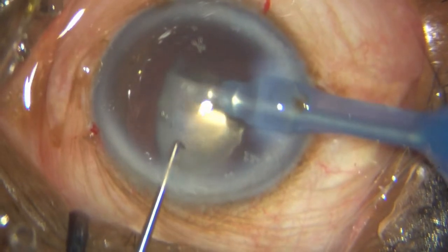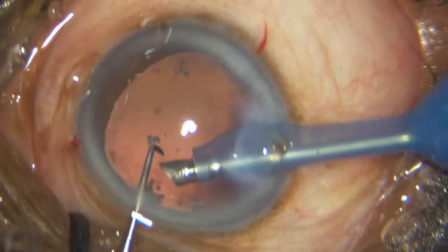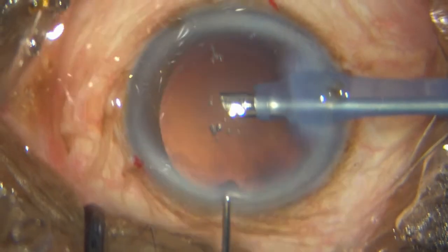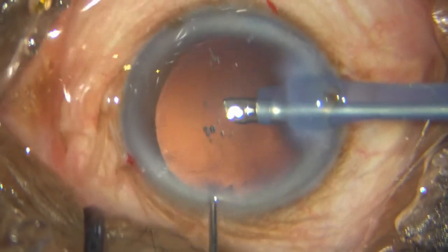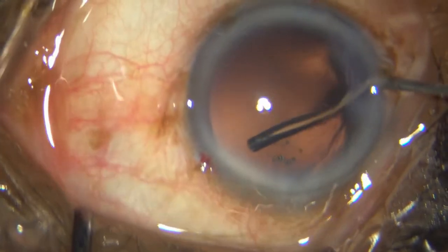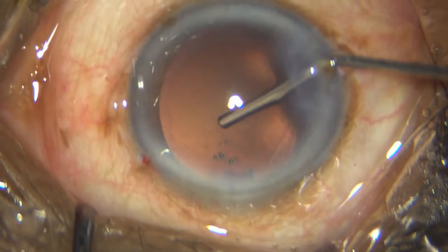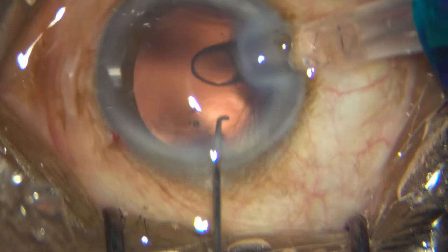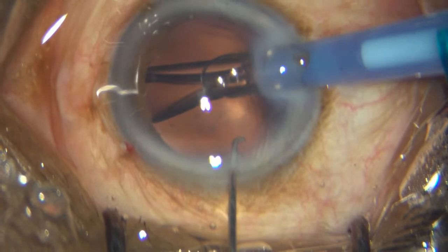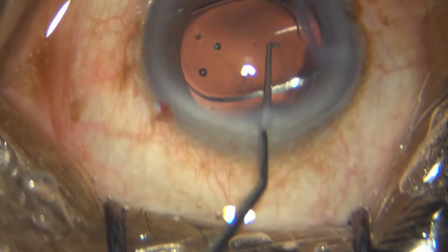Without coming anteriorly, and trying as much as possible to deter any of those pieces flying around in the anterior chamber and hitting the endothelium. Once that's done, there's hardly any cortex. There are some posterior capsule opacities and some fibers, but the capsule is so loose it's not worth taking the risk of trying to clean that capsule.